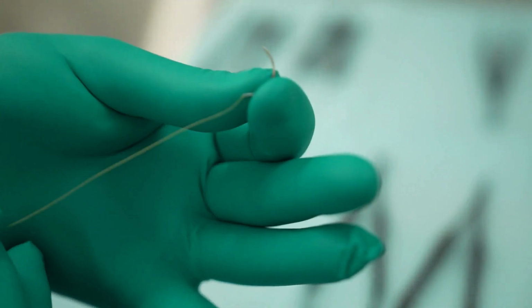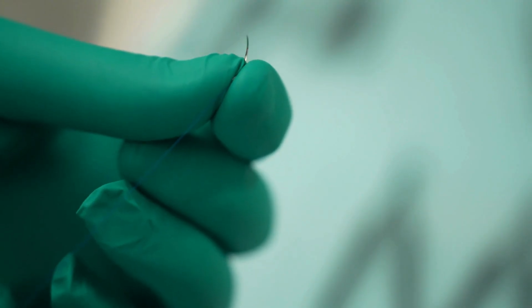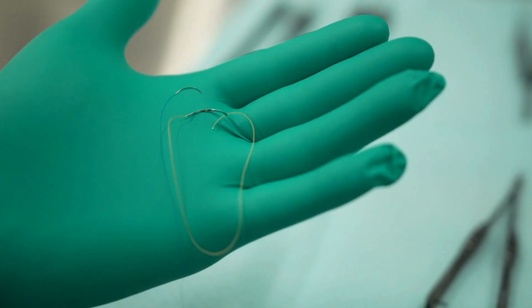If you see the difference between the suture that I usually use in a normal procedure compared to the one that I use with the microscope, you can easily understand why the patient has a lot less pain and discomfort afterwards. It's a much more delicate procedure that allows the patient to have a much faster recovery, and for me as a periodontist, a much more predictable outcome of success.